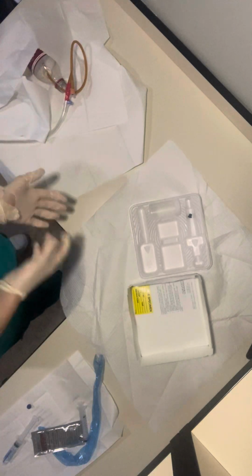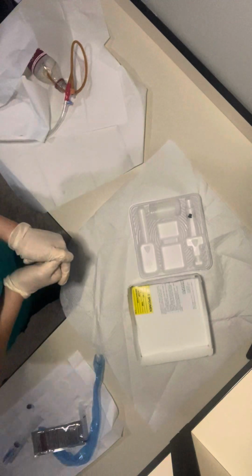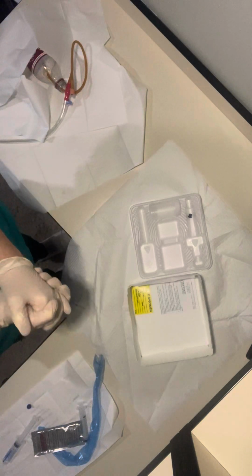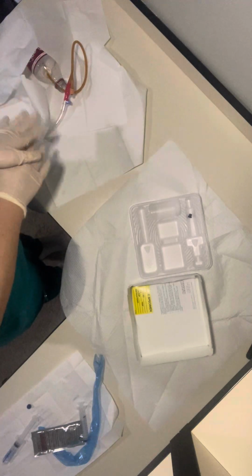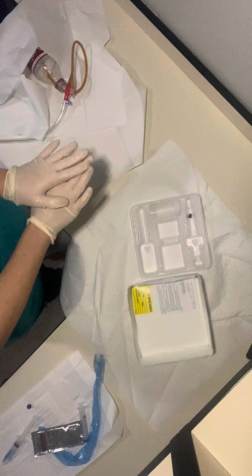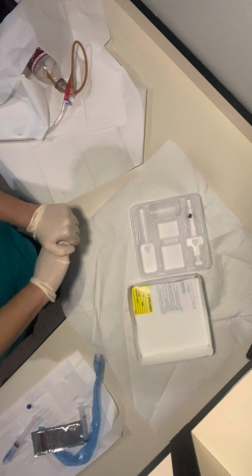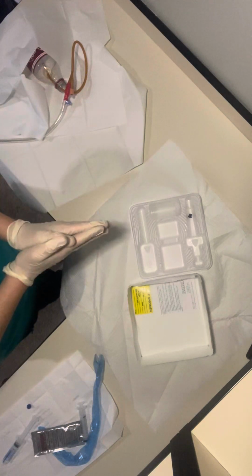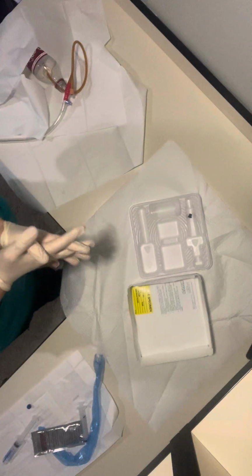At that time, making sure that I put the label on it with the name, room number, and all the information needed for the lab, and then I would send it off to the lab. I would make sure my patient was comfortable, put them back into a comfortable position, make sure everything was cleaned up, the catheter was secure, and cover the patient back up at that time. And then after that, I would just make sure they didn't need anything, perform hand hygiene, and check on them in a little bit. Thank you.